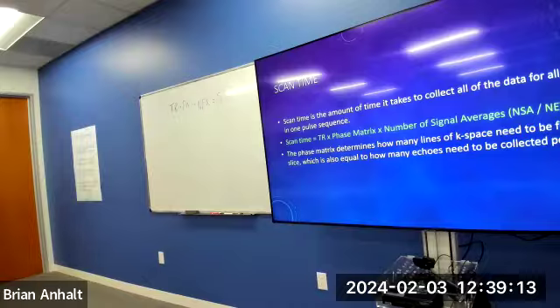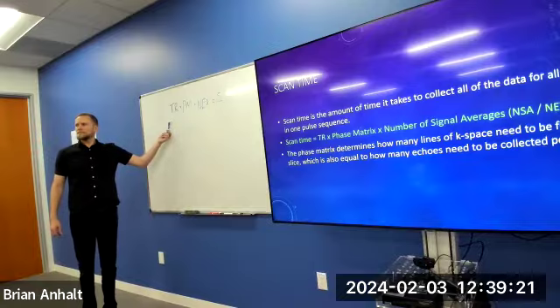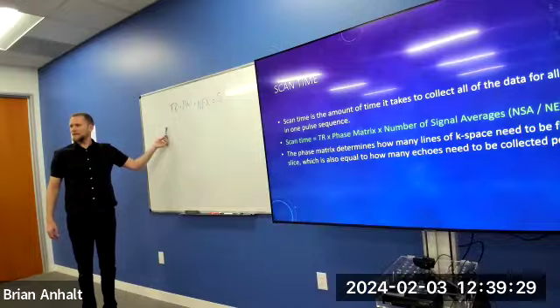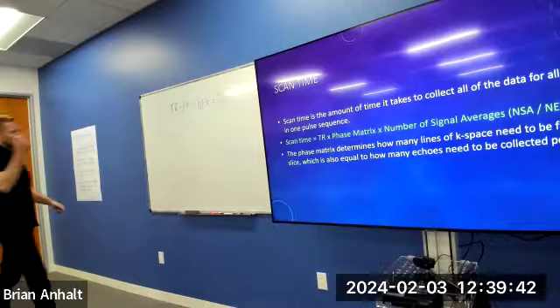So we can start to see some other trade-offs as well. If I lengthen my TR, what is the trade-off? Higher scan time, right? What else? Decrease in T1 weighting. What else? That increases SNR up to a certain point. And then what else? Think of multi-slice acquisition. More slices available, right?